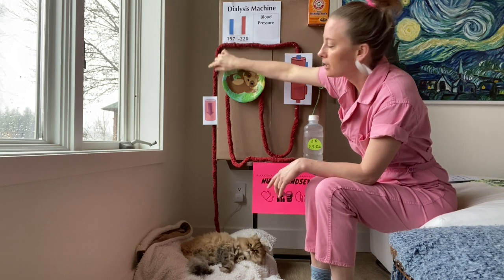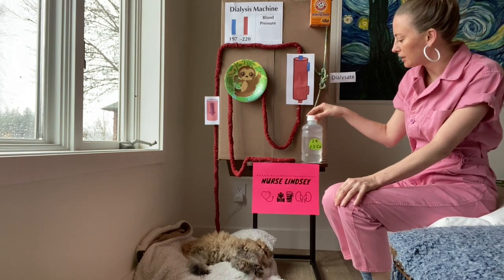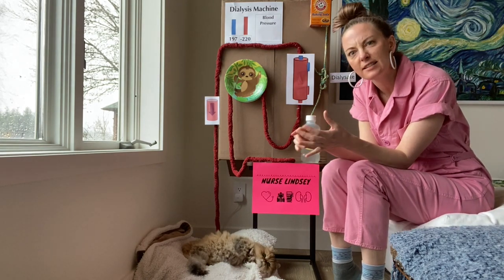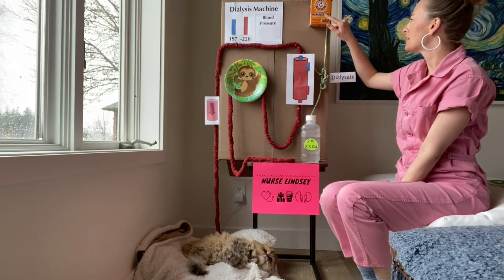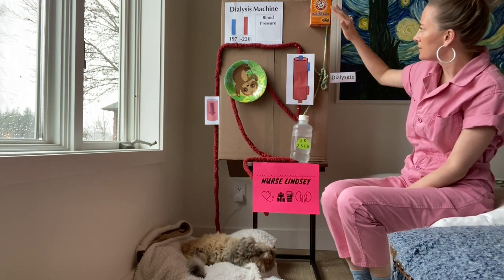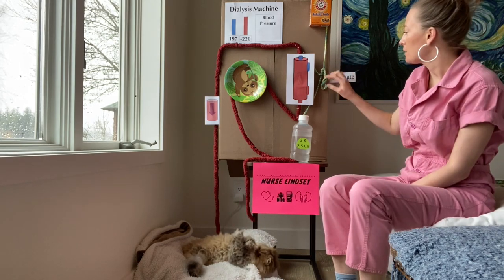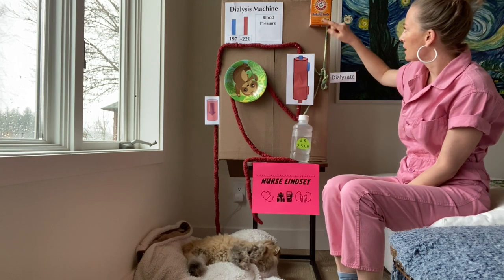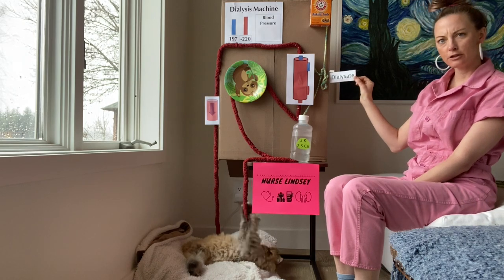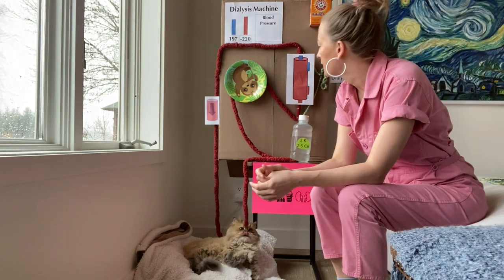One of the safety features of these machines is a system air detector alarm. We also have a liquid acid concentrate — it usually has potassium, calcium, magnesium, and citric acid — and then we have sodium bicarb, or baking soda. This is an acid and this is a base, and they mix to form a pH of between 6.8 and 7.3. When this acid concentrate and the sodium bicarbonate mix together, they form something called dialysate — and this is where the diffusion happens.